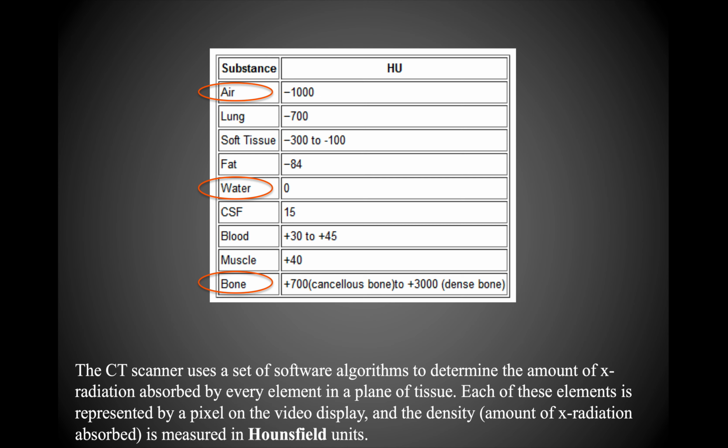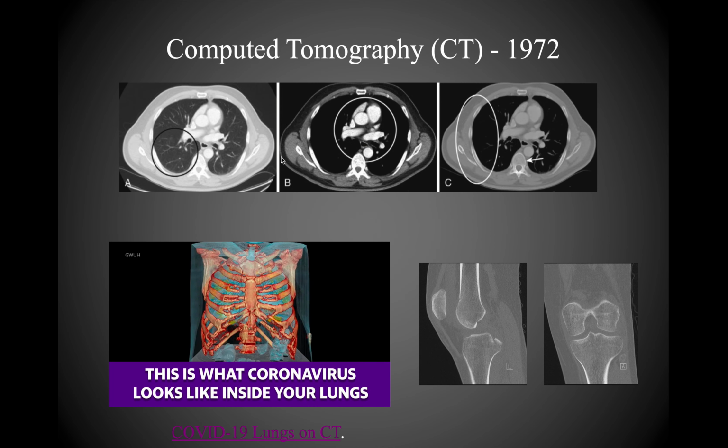However, due to the computer manipulation, there can be some deviations from that of X-ray. So for example, I'm going to go back here for just a moment. This top image here, you can appreciate that this is the same image with 3 different windows. On the upper left, this is where the window is optimized to see more air-like structures, so the lungs are best appreciated there. And in this one, mediastinal structures are best appreciated, which you can see circled here in the middle. And then finally, this is the bone window on the far right, where you can appreciate bones better on this type of window.